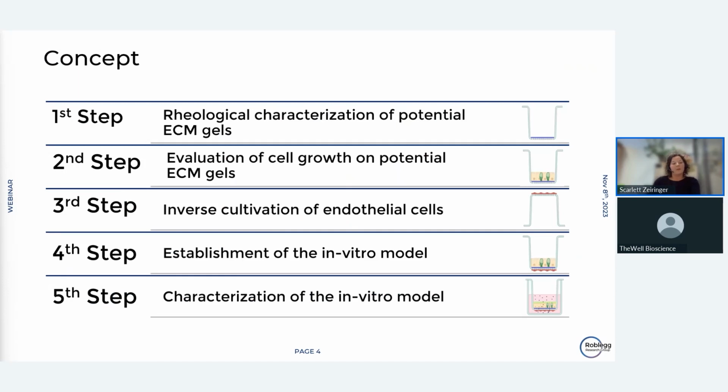In the first step, we evaluated animal-free gels for the simulation of the ECM, which have similar rheological properties as the human ECM. In the second step, we tested the cell growth on these ECM gels and investigated the effect of the gels on the cells.